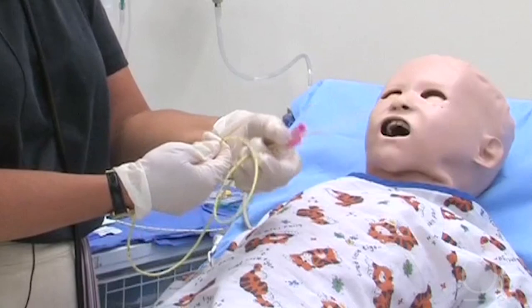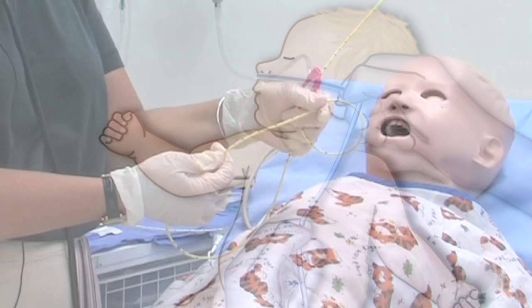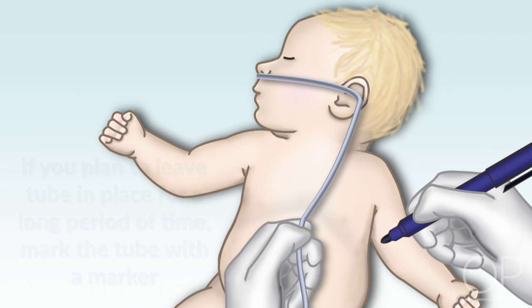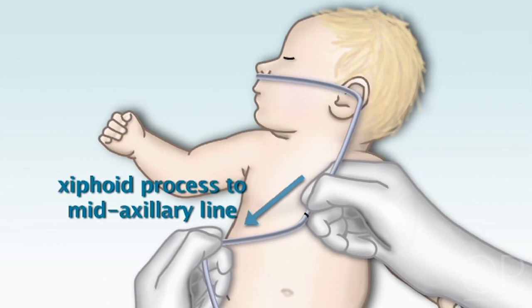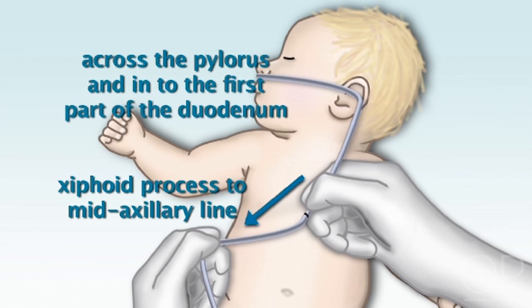These tubes actually have markings on them with numbers, but if you're going to be putting this tube in for long term, a marking with an indelible marker would be the best thing to do. So I'm going to put a mark right there — that will be Mark 1 for stomach placement. The next measurement would be to take the tube and measure from the mid-xiphoid to the mid-axillary line. That would help to get the tube across the pylorus and into the first part of the duodenum. I'm going to put a second marking there.